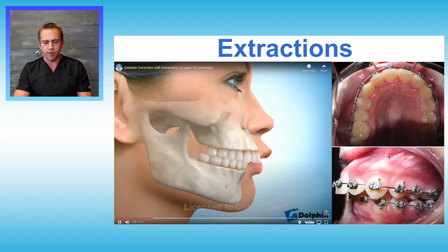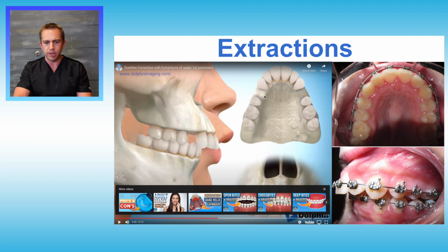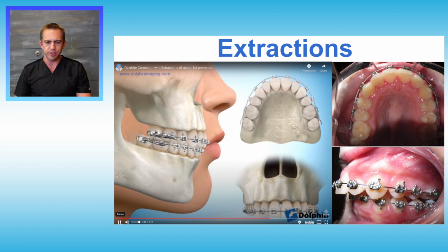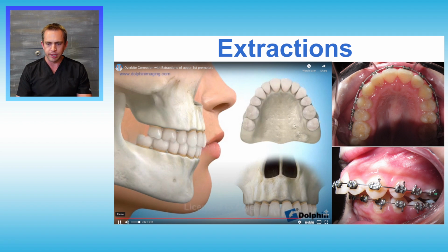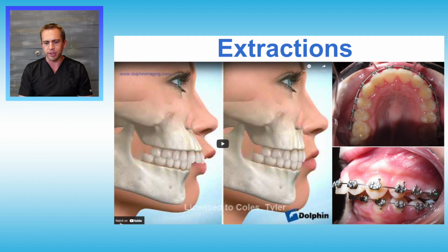So as you can see in the video, anytime that your front teeth stick forward, one way to bring those teeth back is by having 2 teeth extracted on the top. It is the first bicuspids. And then using braces, we can slide those front 6 teeth back and correct the overbite. So this animation will demonstrate that. So you can see these front 6 teeth slide back, and by the time everything's finished, the overbite's corrected and all the spaces close as well. So that's what we decided was the best option for this patient.